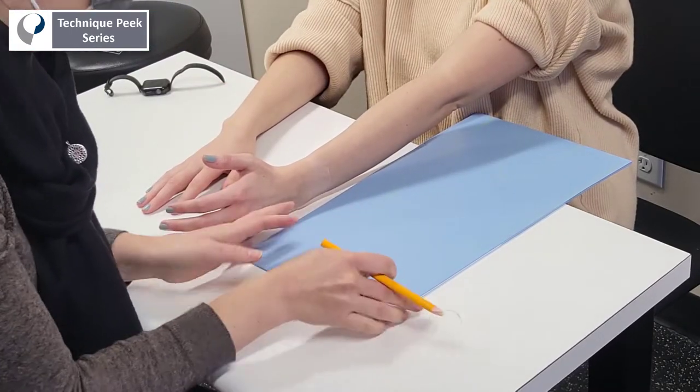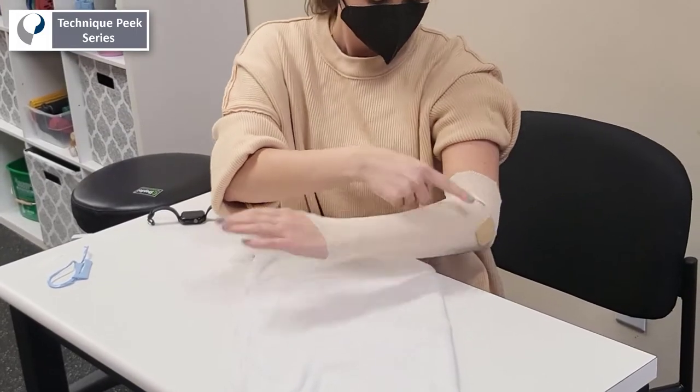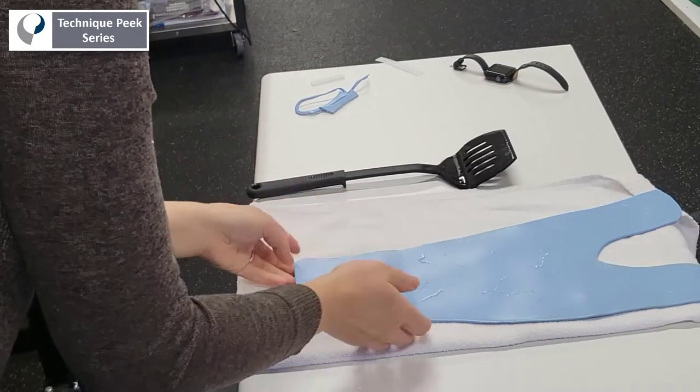While your material heats, you can pad the medial and lateral epicondyles as these are areas of high pressure. While the material is warm, cut out your pattern and roll the edge of the thumb hole outwards in preparation for molding.